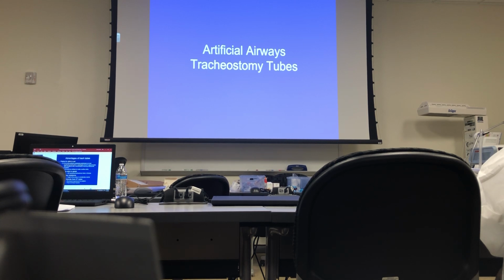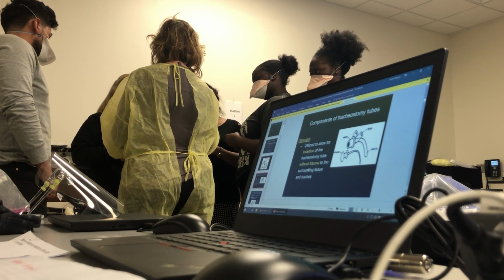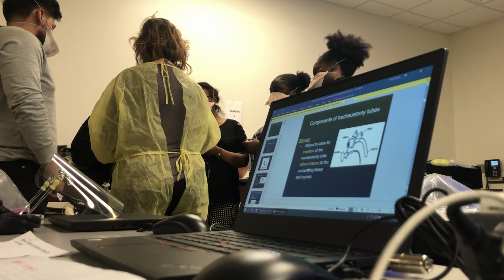You pretend, here, I'll hold your, I want you to put your hands around that as if you're the trachea. Okay, just not squeezing. So, I'm gonna check your pressure. Okay, it's very high, and I'm gonna drop the pressure. Whoa. Feel the air coming out of it? Now that would be acceptable pressure against the trachea, okay? Between 30 and, below 35 centimeters of water pressure. Make sense? Okay, let's see how your balloon is.